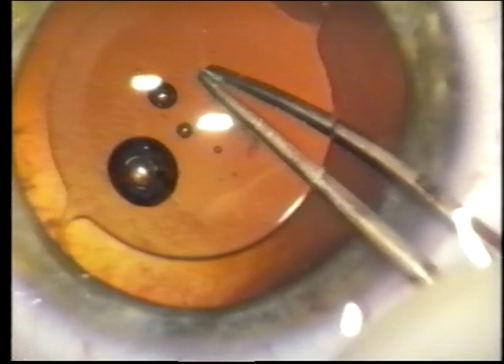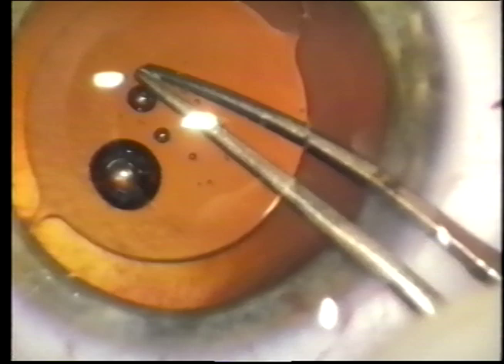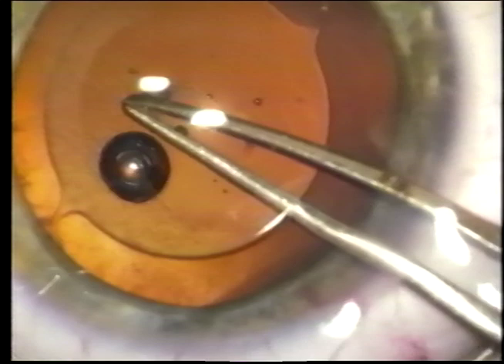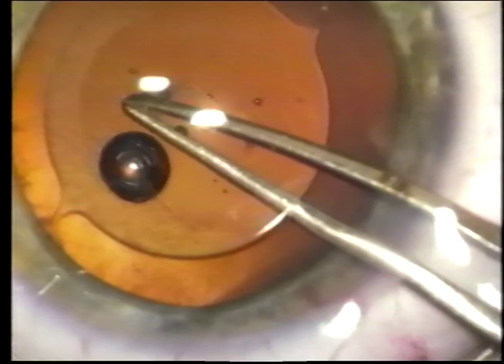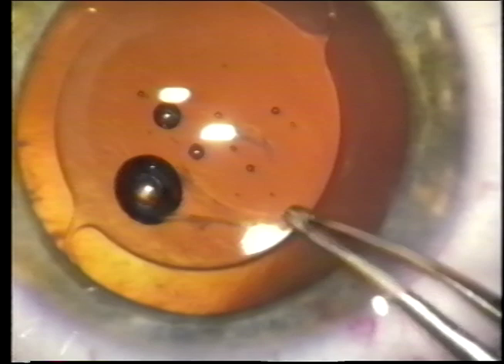More viscoelastic is being added; sometimes the viscoelastic being added is to disperse debris or air bubbles to improve visualization. We first used this technique in April of 1993 and as of February 1994 we have used it in eight cases so far and haven't had opacification of the visual axis in any case. This tissue fragment will be removed after a scissor snip is taken underneath it to ensure no attachment to the vitreous.